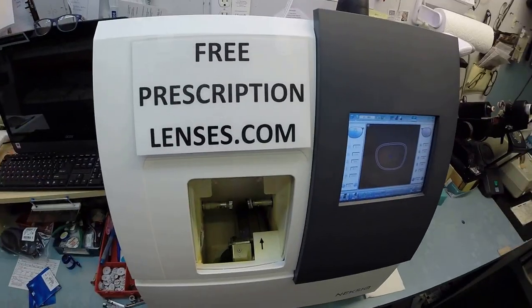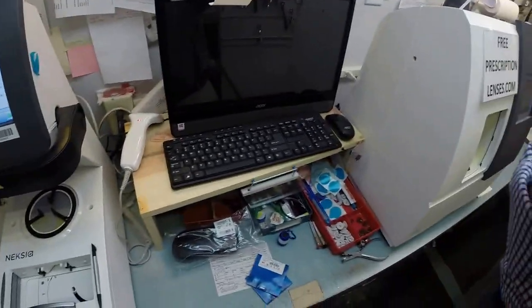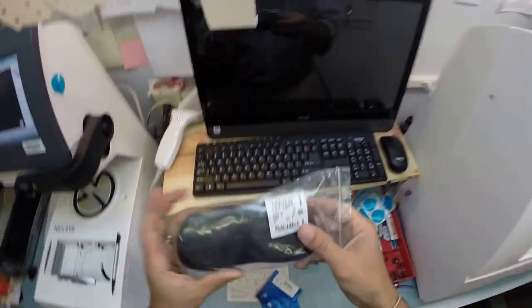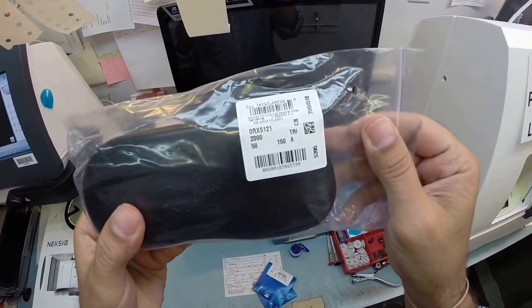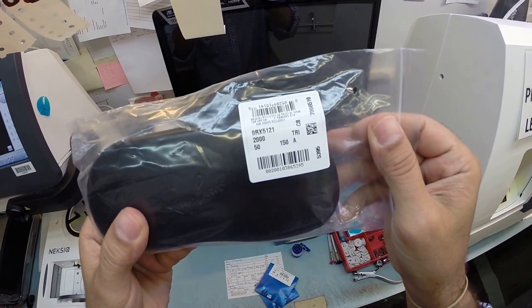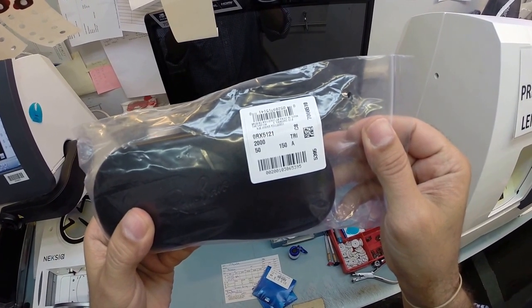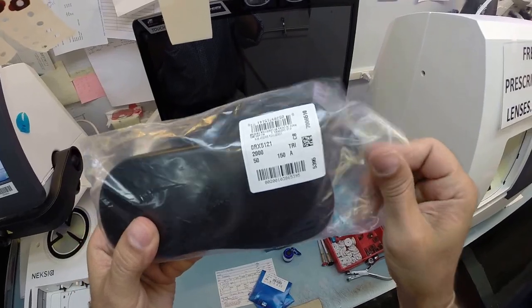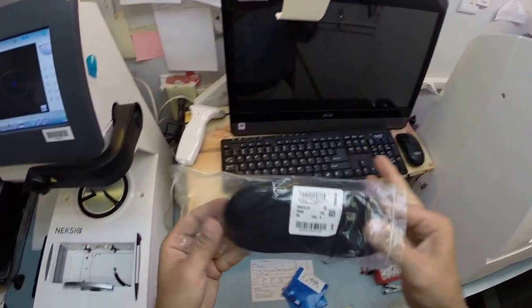Hello, Hola Olayinka in Phoenix, Arizona. Matthew here with FreePrescriptionLenses.com and with the help of my GoPro camera, I'm going to show you how I cut Transitions gray lenses for your Ray-Ban 5121 Wayfarer, color 2000, which is the classic shiny black in the 50 eye size.